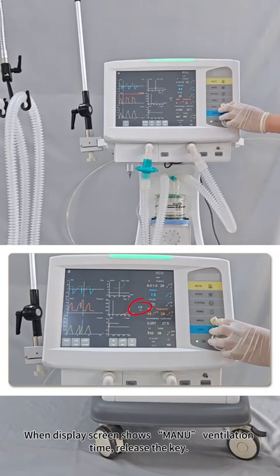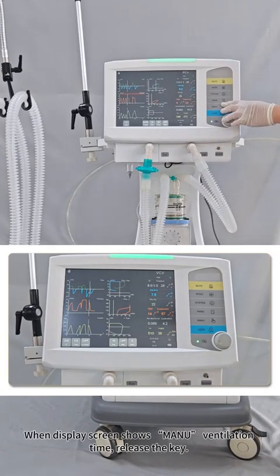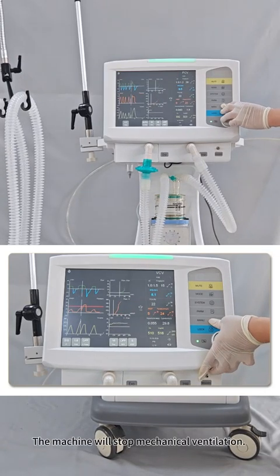Press the Manual key. When the display screen shows the manual ventilation time, release the key. The machine will stop mechanical ventilation.